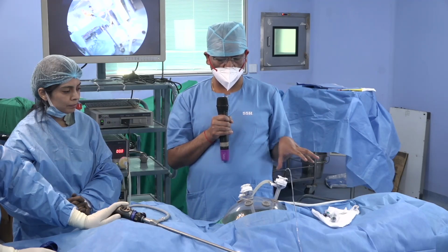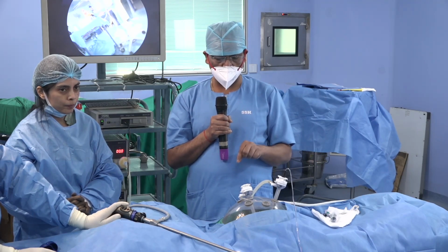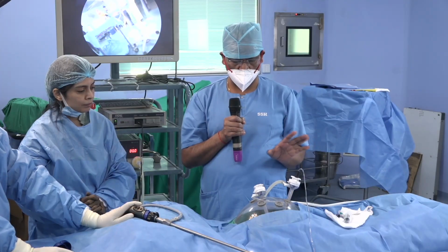Otherwise, you always have to palpate and feel whether there is no disease there, and then you put the port. So usually people put it, and even I put it, in this left subcostal space, and that is usually possible in 95% of cases.